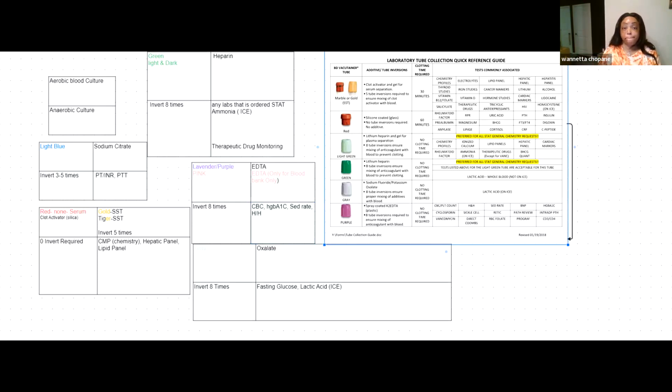Okay. I have H&H right here. Let me go ahead and move that down to the side. You can write it down if you want, but it's not as important for you to memorize like those other three. And H&H stands for hemoglobin and hematocrit, which you do see on your paper, H&H.